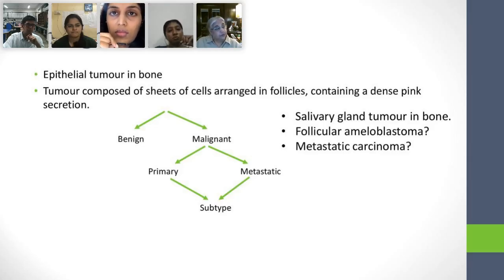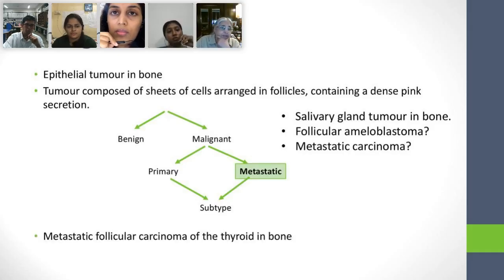Salivary gland tumor, yeah. If you think that all these round structures can occur in, say, an acinic cell carcinoma, but you think an acinic cell carcinoma primarily will occur in the bone? The answer is no. So this must be very low on your list. So what is the diagnosis? It's probably a metastatic carcinoma with a follicular appearance. Which metastatic carcinoma has a follicular appearance? Only one, no? Thyroid. Metastatic follicular carcinoma of the thyroid in bone. It's not a difficult diagnosis.